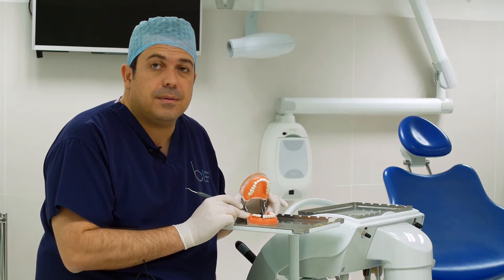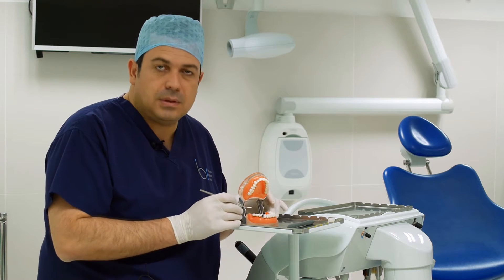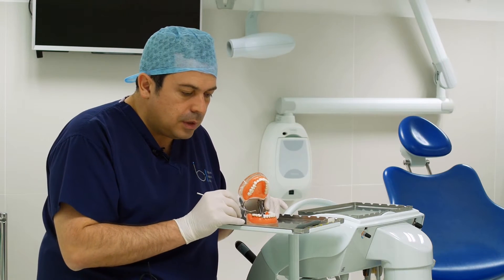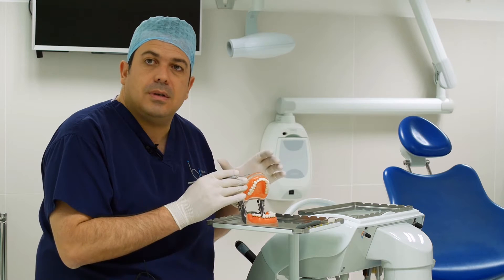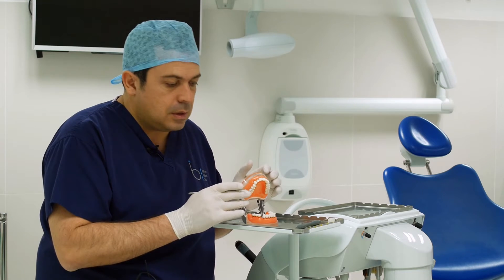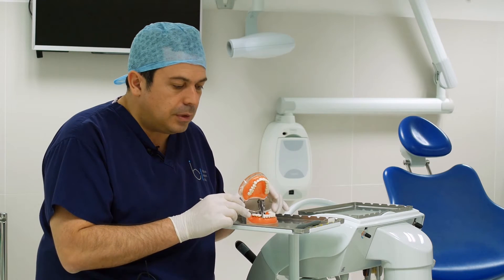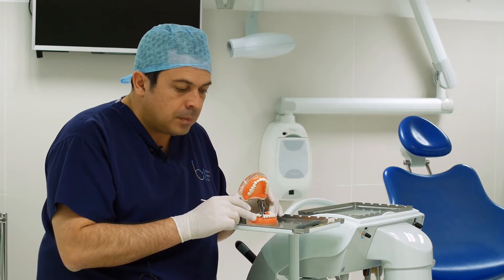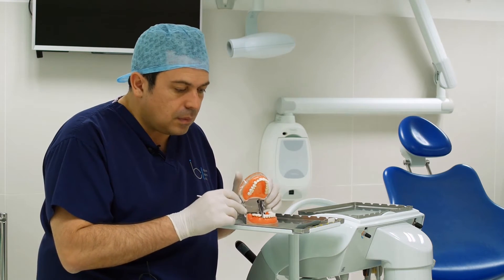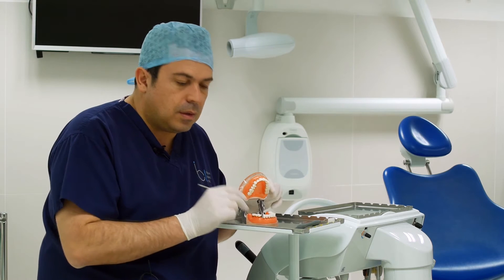A manual scaler can be used to clean any remaining plaque or tartar in difficult-to-reach areas. As a follow-up after a few weeks, your dentist or hygienist will ask you to return and again use the periodontal probe to measure whether the pocket depths have stabilized or improved. Once the hard plaque buildup is removed, the gums have an opportunity to reattach to the teeth, and the probe should reach a lesser depth than when the gum problem was initially diagnosed.